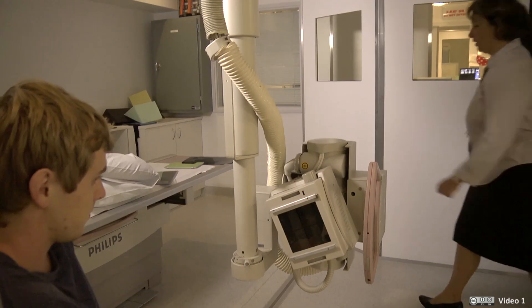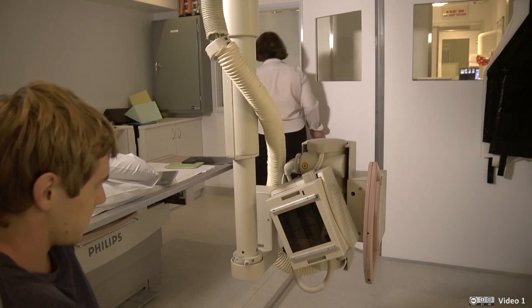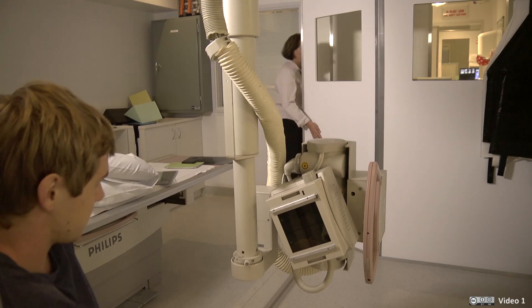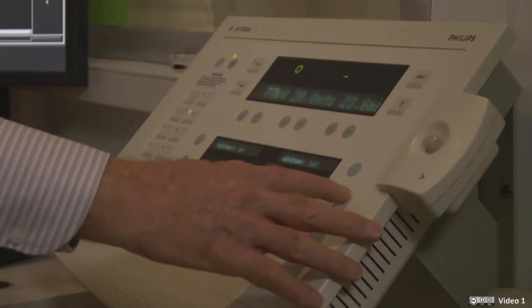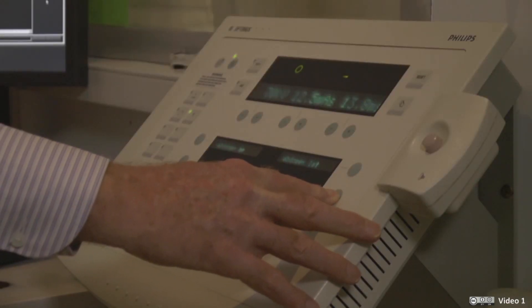The radiographer can then retreat behind an x-ray shield containing lead to operate the x-ray exposure. In most cases, it takes less than a second for each exposure.